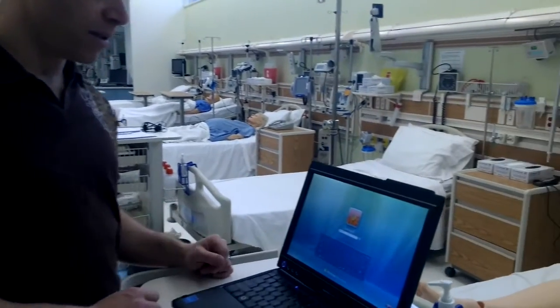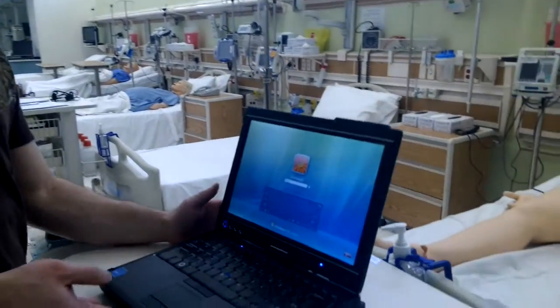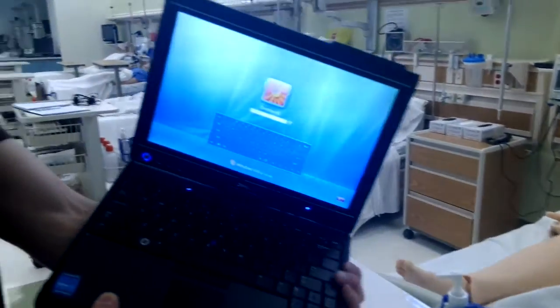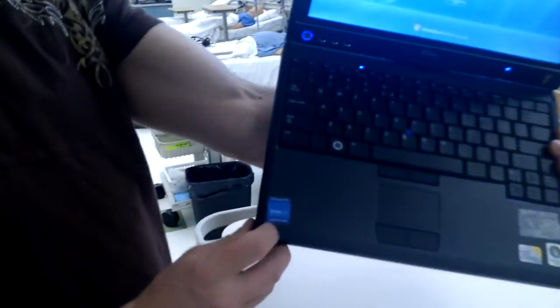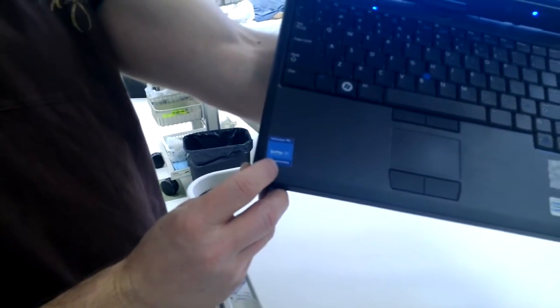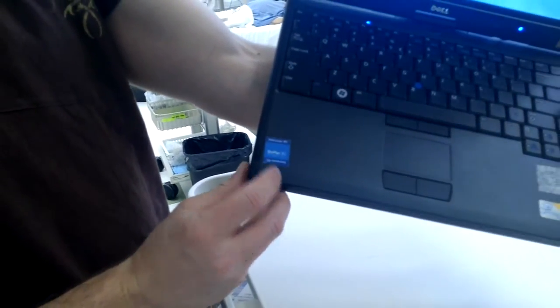Here we have the SimMan 3G Instructor PC. We know it's the Instructor PC thanks to this blue sticker in the bottom left hand corner.